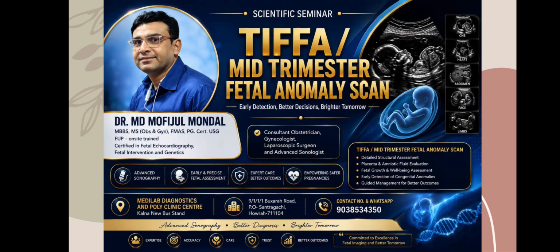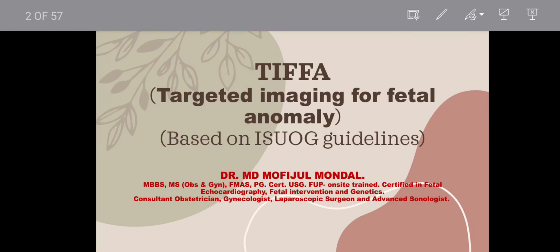I'm Dr. MD Mofijul, and today we will discuss one of the most important examinations in obstetric ultrasonography, the targeted imaging for fetal anomaly scan, commonly known as TIFFA scan. The International Society of Ultrasound in Obstetrics and Gynecology developed standard guidelines for the mid-trimester anomaly scan or TIFFA scan.